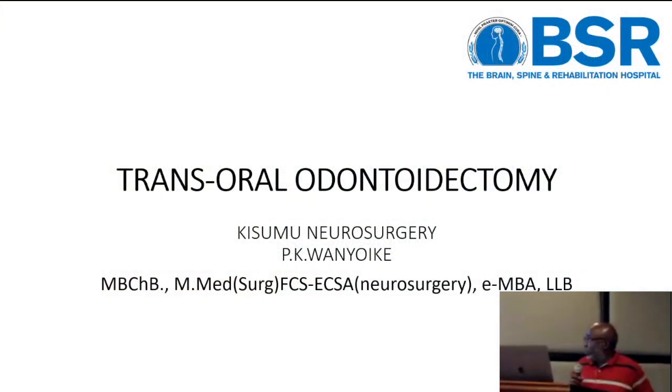Also, odontoidectomy, or transoral anterior craniovertebral decompression, provides us with an excellent approach to the decompression of the craniovertebral junction, the ventral compression.